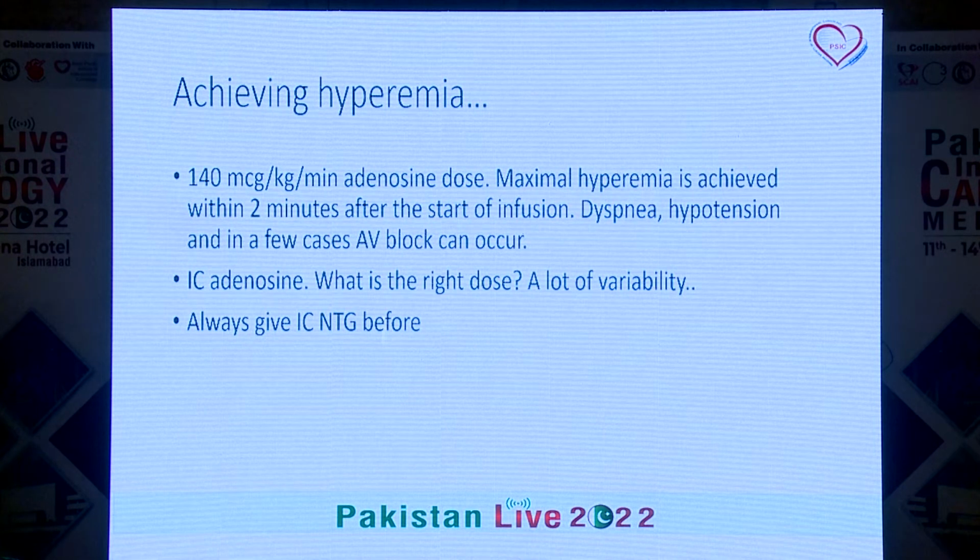Intracoronary adenosine dose is not like a gold standard. There have been multiple trials looking at it, and there is variation in the dose used. I personally use a 40 to 60 microgram dose for the right coronary artery, about 100 to 150 micrograms max for the left coronary artery, and generally it correlates well. So if you have an iFR value which is significant, and I get an FFR which is significant with intracoronary adenosine, it supports my finding good enough.